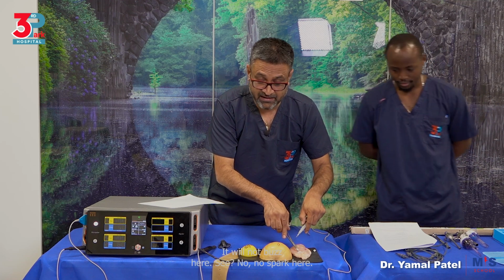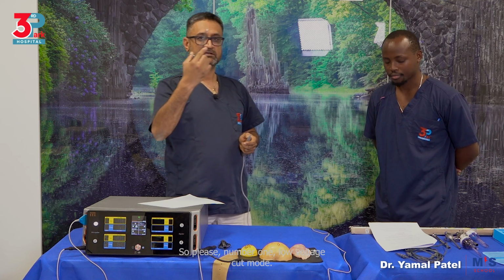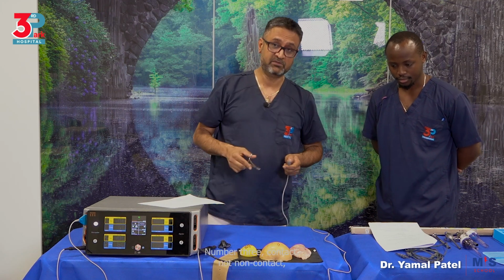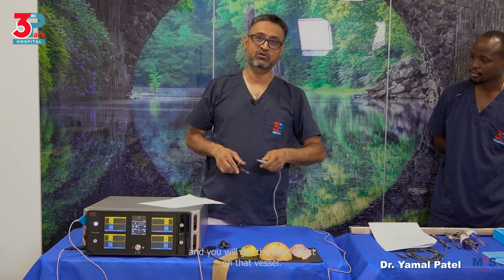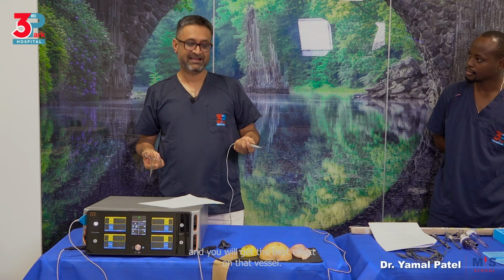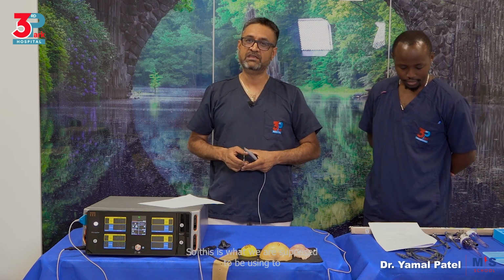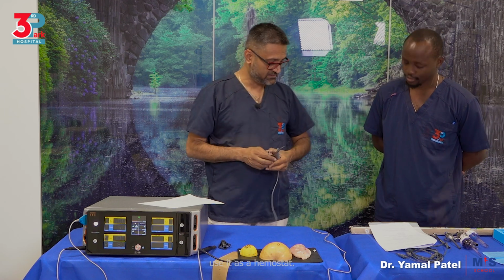See, no spark here. So please, number 1, low voltage cut mode. Number 2, fine holding. Number 3, contact, not non-contact, and you will get the best effect on that vessel. So this is what we are supposed to be using to use it as a hemostat.